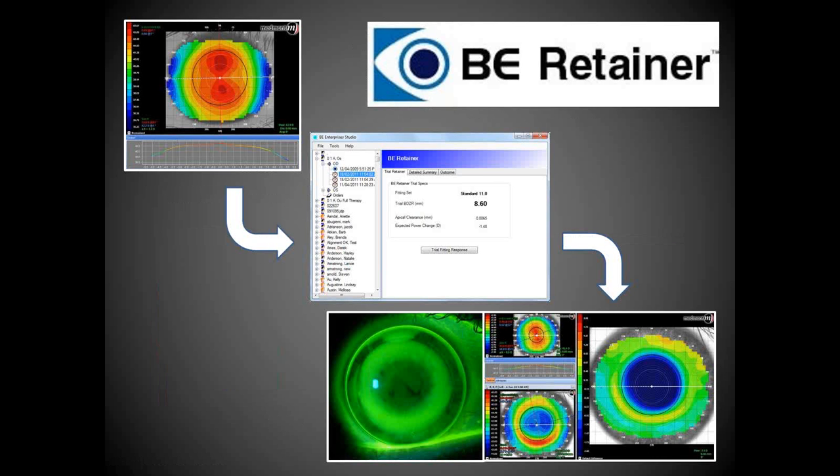Now, the BE Retainer is one of the lenses that we've used tonight to create some of these Ortho-K changes that we've seen. And the way the BE Retainer works is it's one of the designs that employs specifically corneal topography.